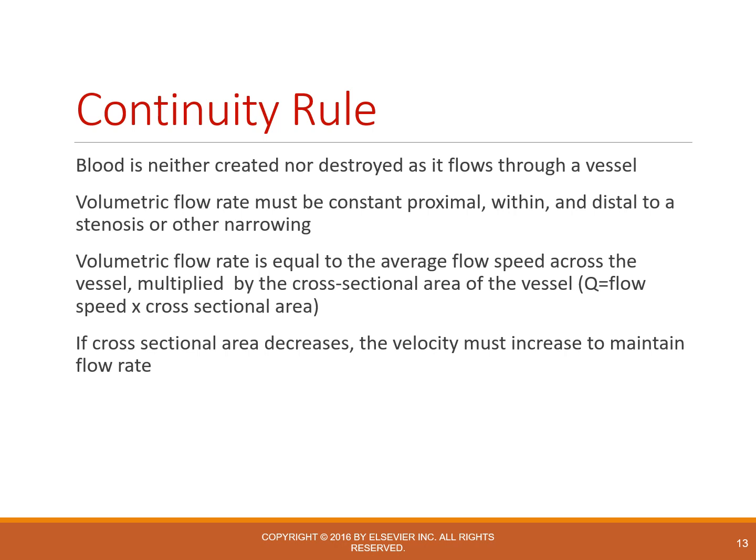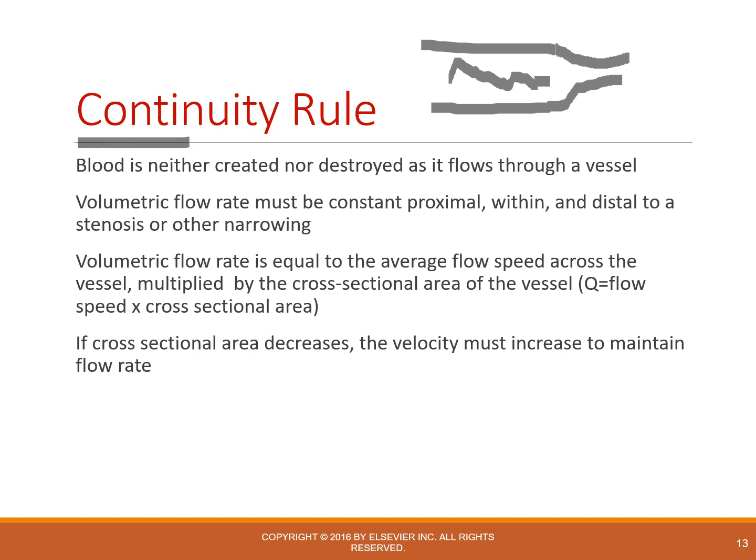Okay, this gets us to another rule called the rule of continuity, and this explains why blood does what it does, especially in a stenosis. So, because like all matter, blood cannot be created nor destroyed as it flows through a vessel. So, if I have a nice open vessel and then all of a sudden I come across a narrow stenosis, it says I have this much blood in here, and I cannot get rid of some just to make it comfortable to get through this stenosis. So in order to move more blood flow through an area or continue the movement of the same amount of blood flow, I'm going to have an increase in my velocity at a stenosis.